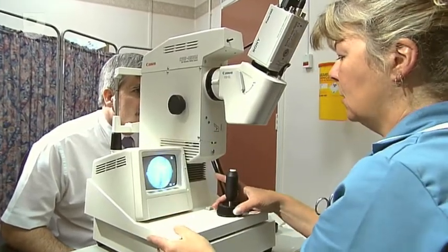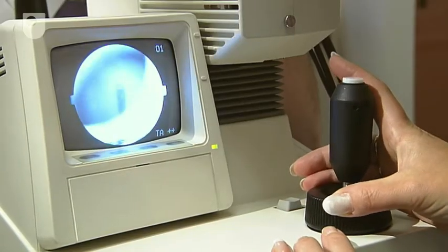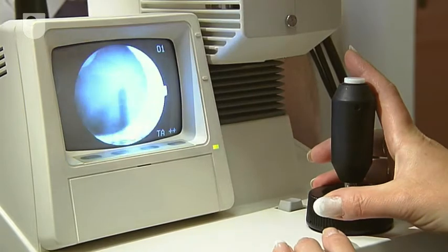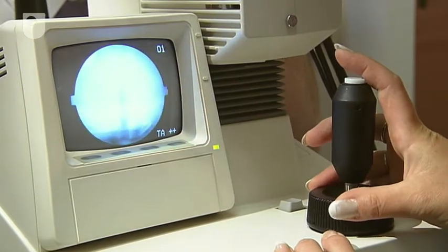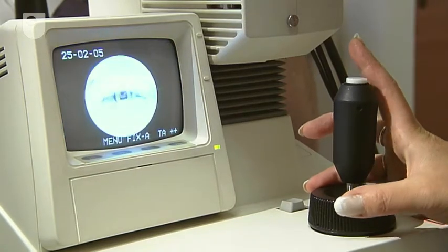I'm just getting your eye in focus. Can you see the green flashing light? Can you focus on the green flashing light for me? Thank you.